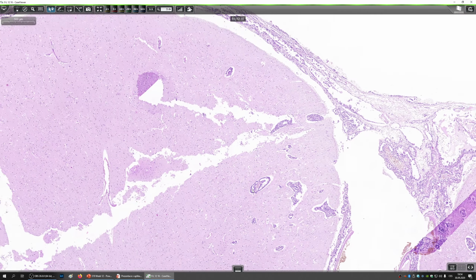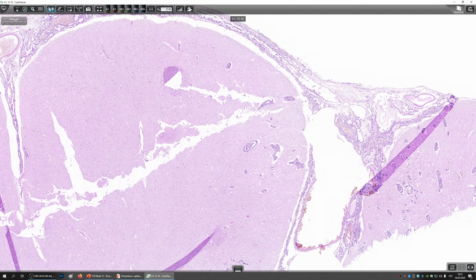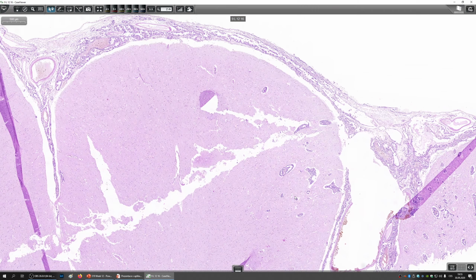So this patient died of this very advanced cancer. If this were a lady, then I would think of breast cancer, but this could also be lung cancer. I don't know, honestly. It's difficult to tell from the morphology, but lung cancer or breast cancer are in the top options for this to happen. These patients have a very poor prognosis and survive just for a few months with this. They are sometimes given chemotherapy injected directly into their ventricular system. And unfortunately, this is a sign of very progressed cancer.